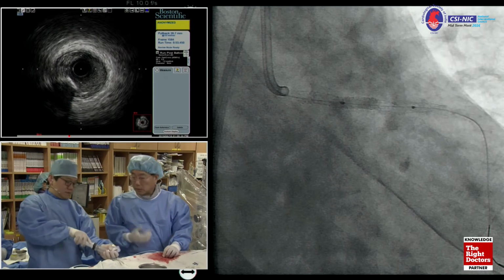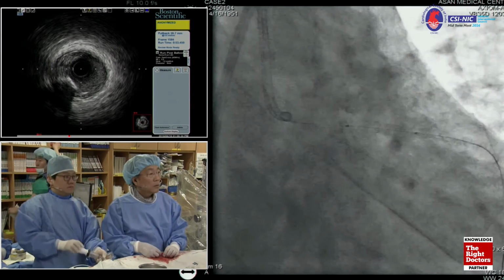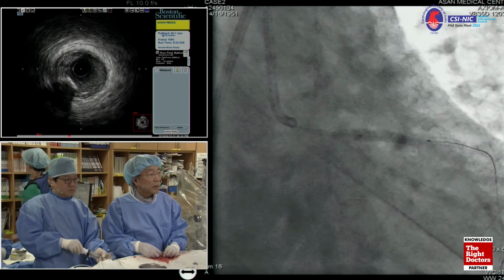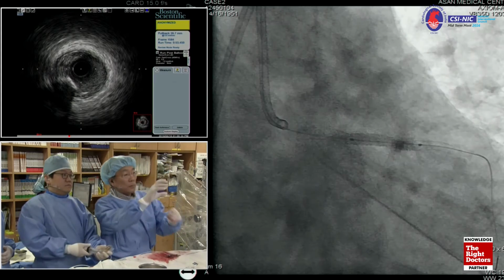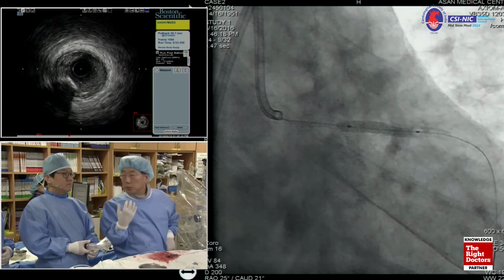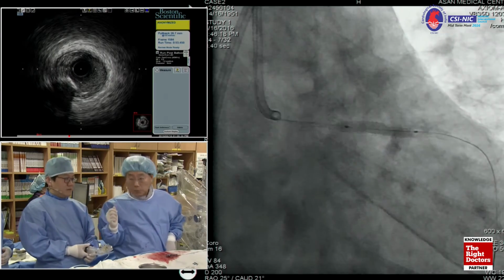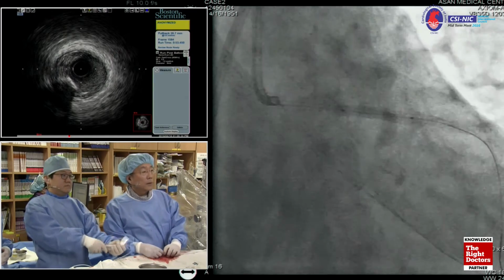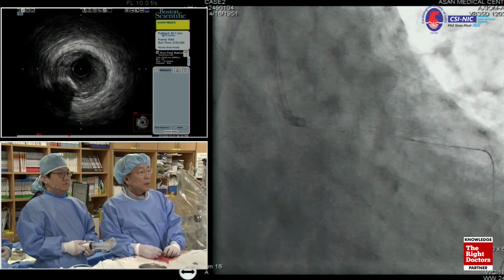Air mainly. Okay, why not? So we can clearly see it. I want to see that. Okay, good, perfect. Some tapering, yeah, but this balloon. The meaning is absolute maybe: stent diameter is balloon. The reference vessel diameter is not too big. It's up to 3.5. Okay, deflate. And proximal LAD and left main.